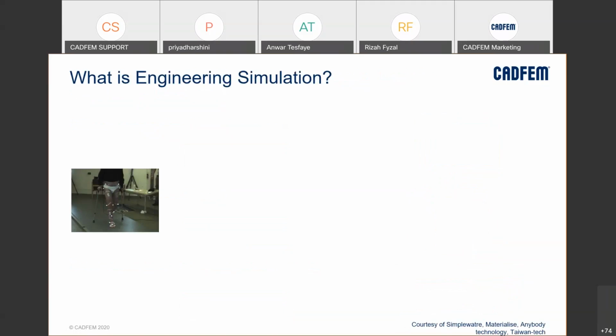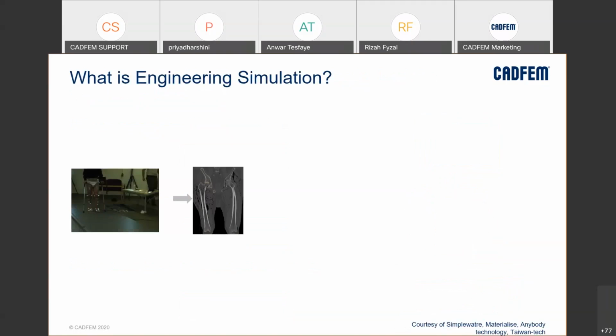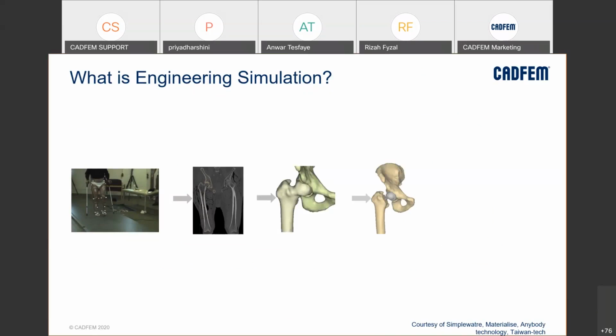Coming to understanding what engineering simulation itself is. Basically, you can take the data through scanning or different methods and make your own STL geometry. Then, taking the implant or any other kind of analysis, you can modify your geometry in SpaceClaim. I will show a demo also in the further slides. The second step is to give the proper material data also. For any analysis, the input should be accurate. Your output depends upon your input also, right?